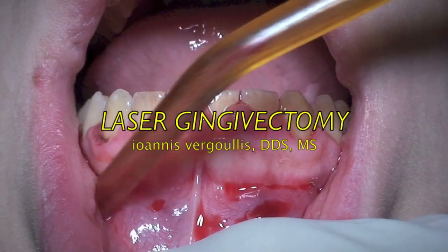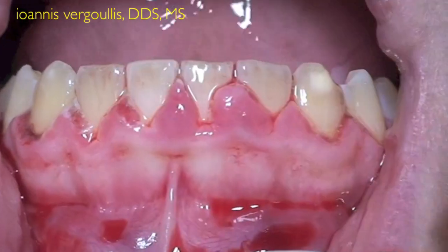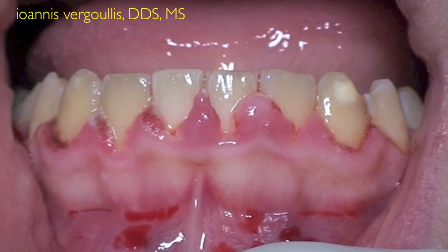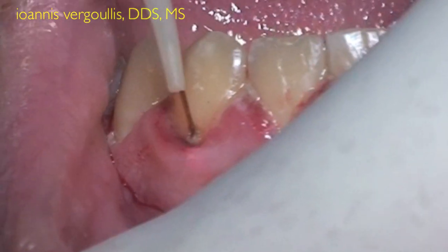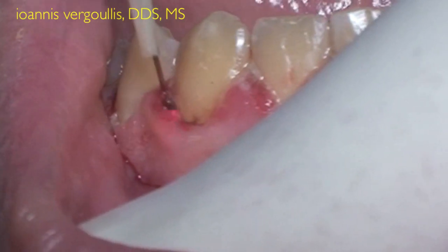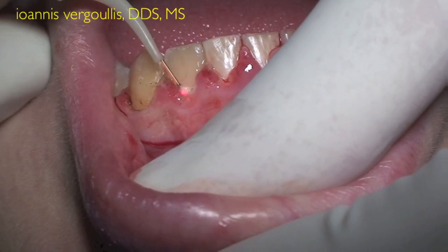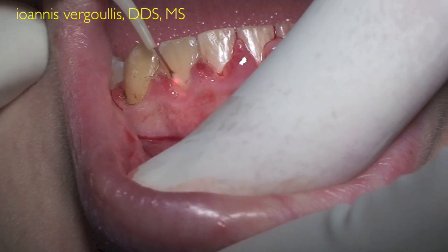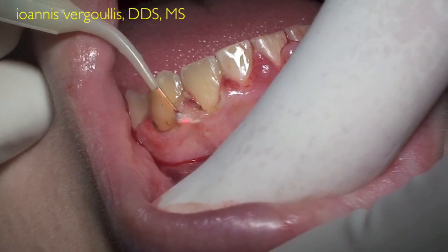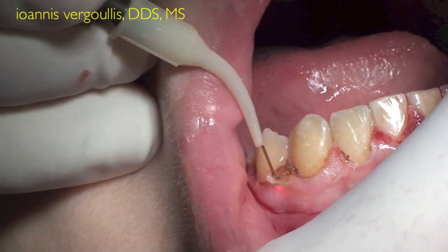This case was presented in our clinic post-orthodontic treatment. The diagnosis was gingival hypertrophy in combination with altered active eruption. Although we explained to the patient that in order to fully expose the crowns of the teeth, we will need to do gingivectomy in combination with ostectomy and osteoplasty, the patient declined from having an osseosurgery. So we decided to proceed with just the gingivectomy and the gingivoplasty.